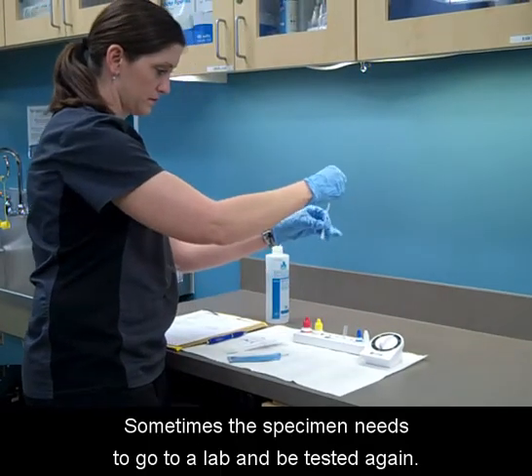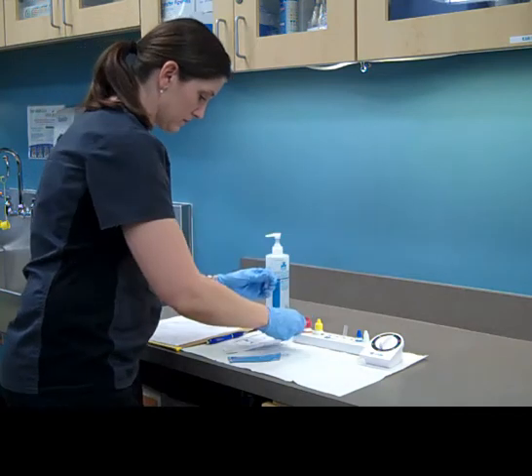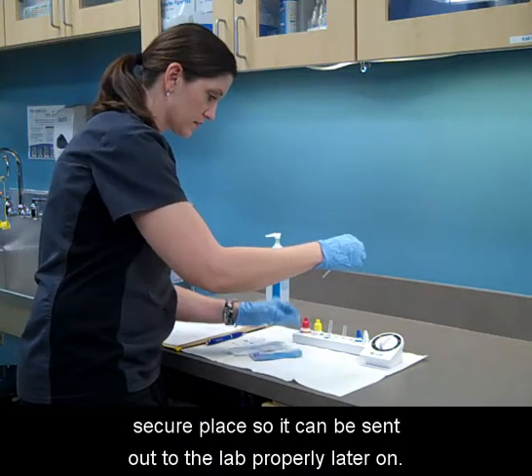Sometimes the specimen needs to go to a lab and be tested again. It is best to ensure that you place that specimen in a secure place so it can be sent out to the lab properly later on.